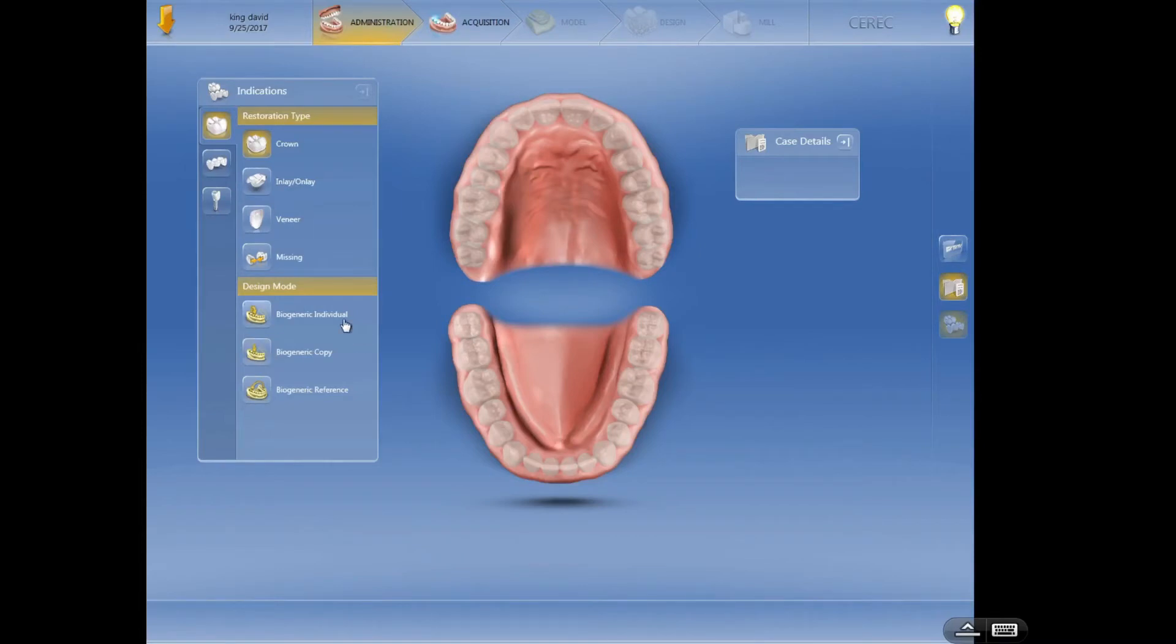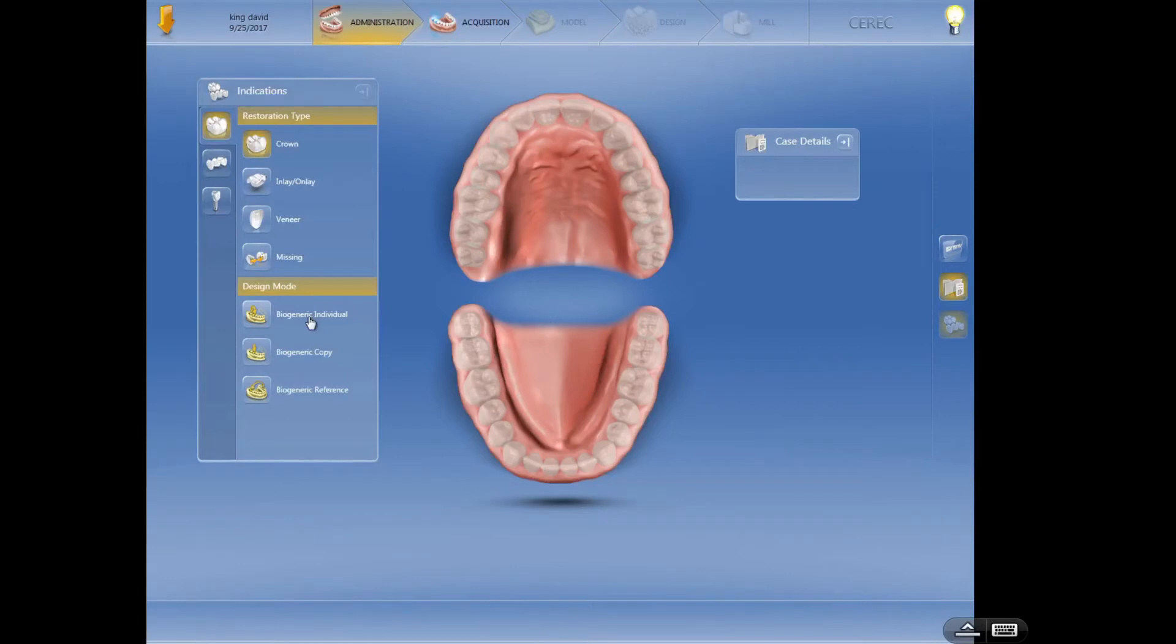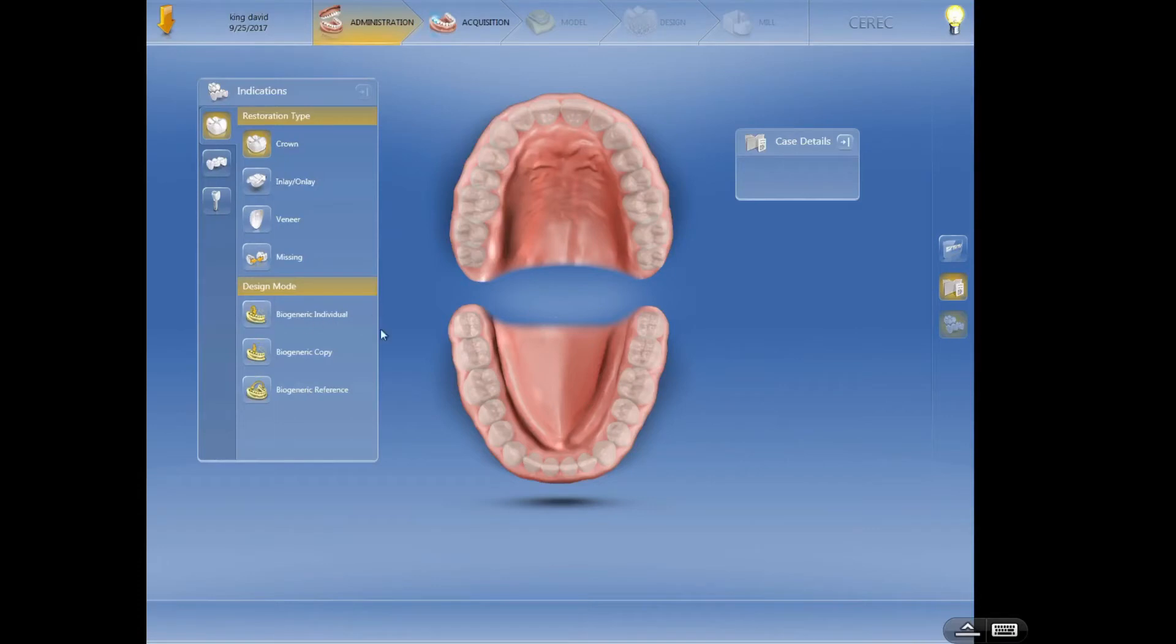So let's talk about biogeneric individual. This particular setting is designed to look at the teeth next to the tooth that you're fixing, you're restoring, and give you an occlusal anatomy that basically matches what the adjacent teeth have. A lot of people go to this with 4.4 software, which this computer is running right now.